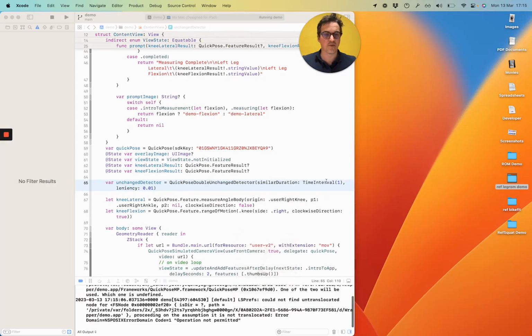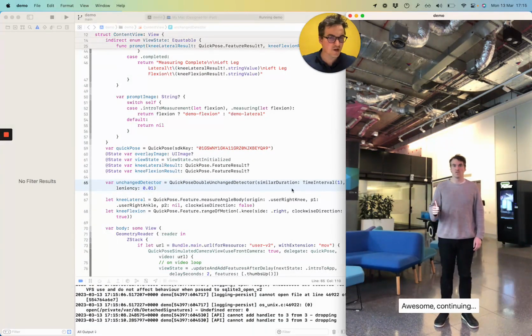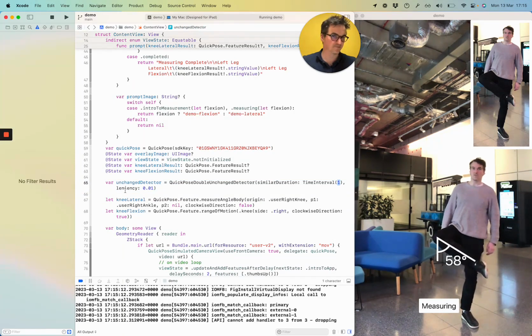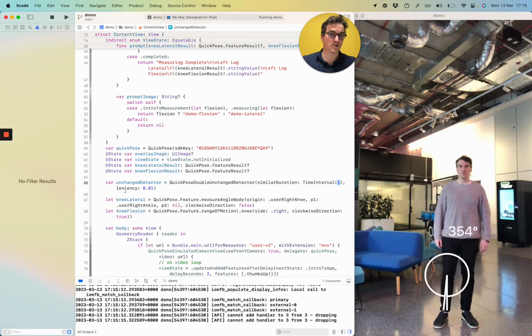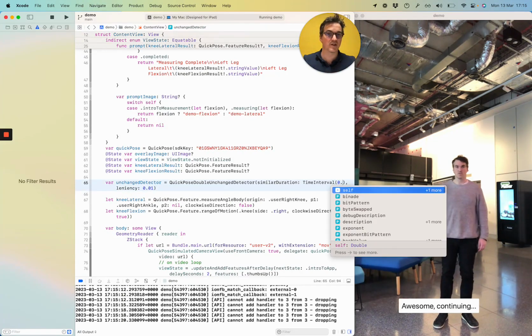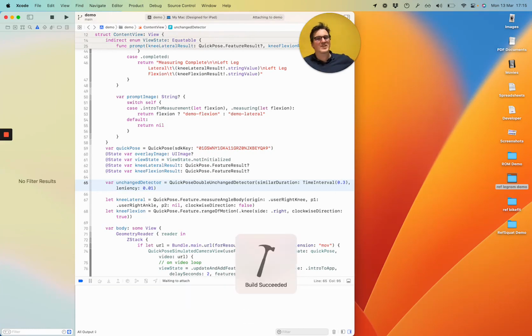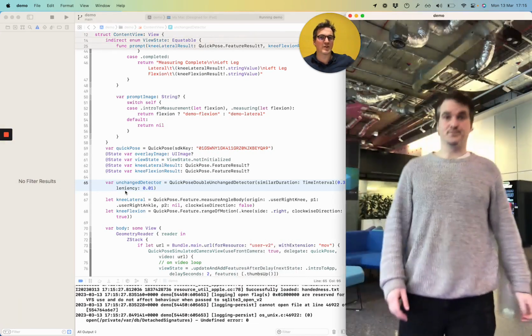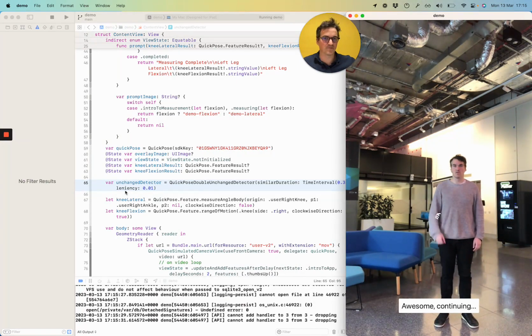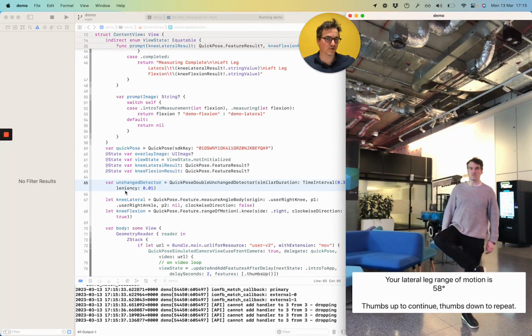So depending on your use case and the values you're using, it's a kind of balance between the time interval and the leniency. So there wasn't a situation hit there where there was a 1 second where the value stayed the same. This is slightly in danger of letting the development video here shape the implementation. So I'm probably going to, this will be the last version I'll talk about.